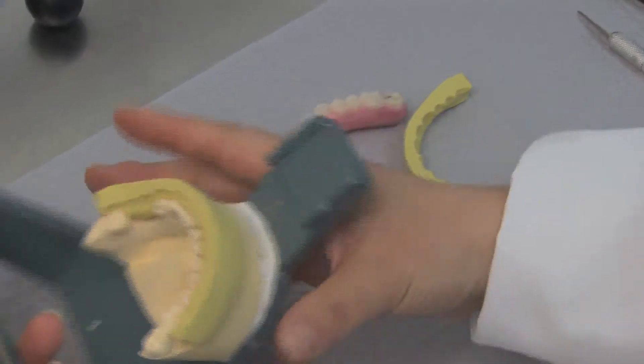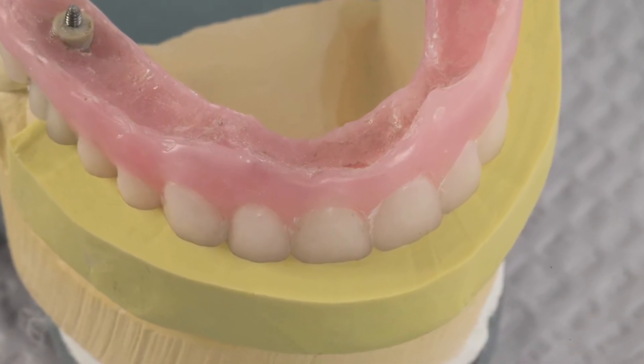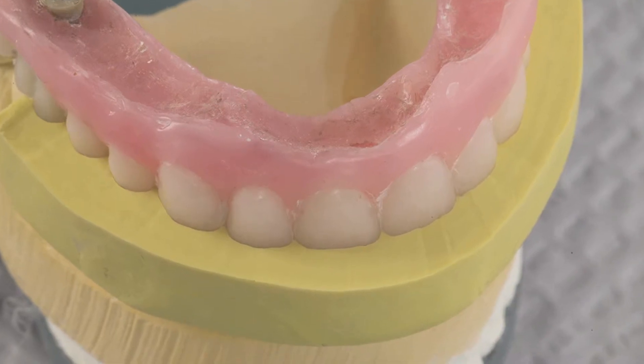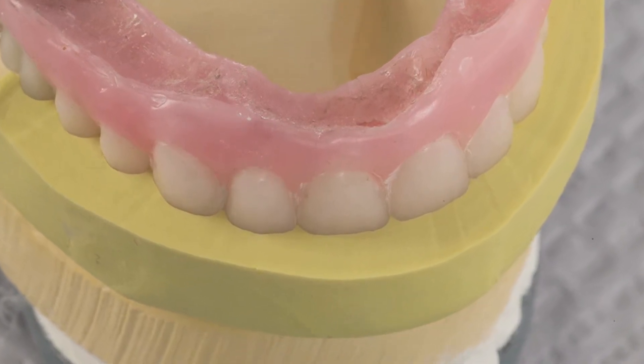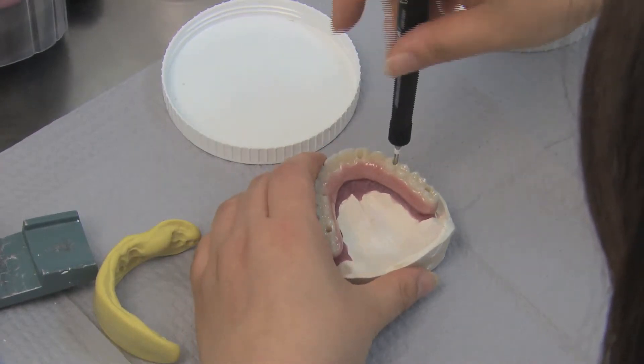The tooth positioning of the denture setup is verified by confirming that there is no space between the putty matrix and the denture setup. The case is then sent for processing and milling.